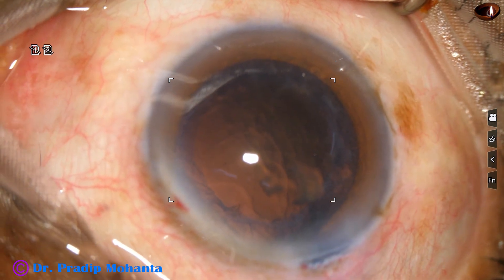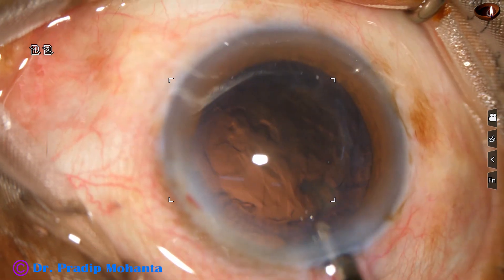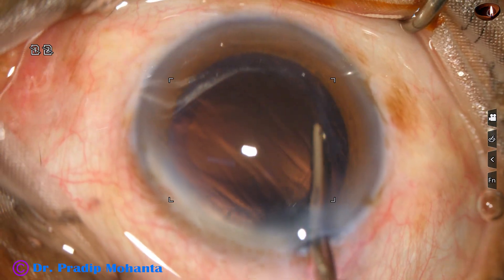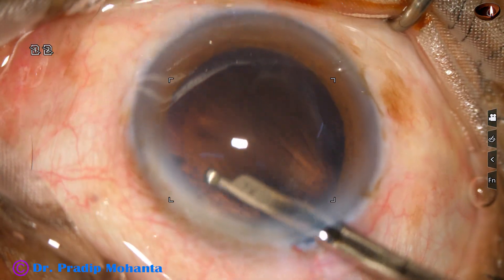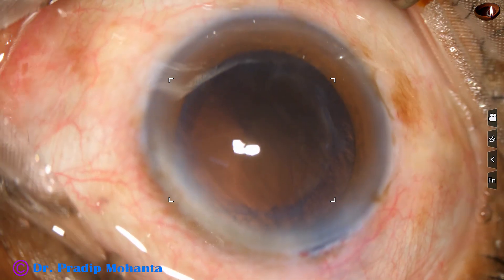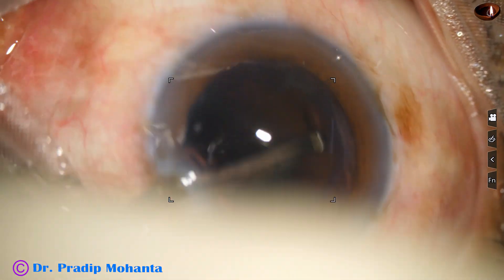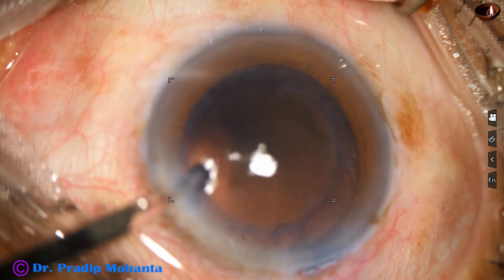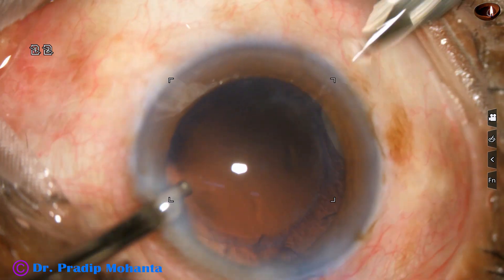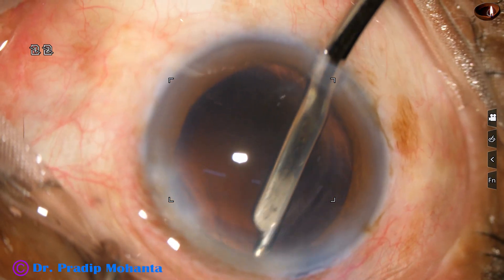Now I am going to use a 23G Simcoe to remove the cortex and debris of nuclear base. Cortex from 9 o'clock, 8 o'clock, 2 o'clock, and 3 o'clock. Through the left side port, I tried to remove the cortex from the sub-incisional area, but it was cumbersome. So I made another side port at 7 o'clock posterior to the limbus. And now I go through this side port and remove the cortex from 12 o'clock.